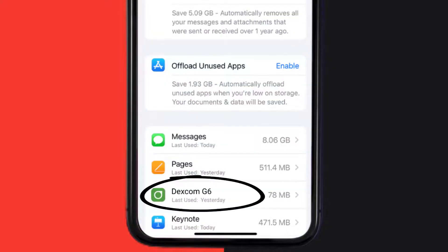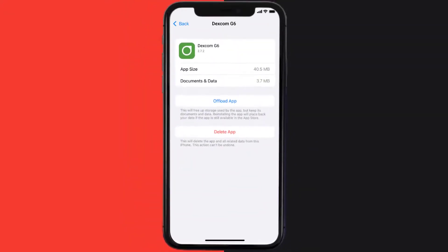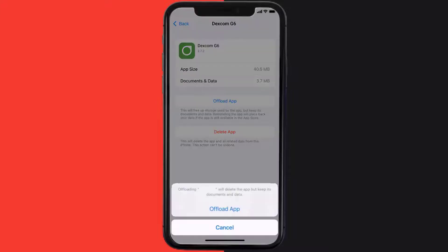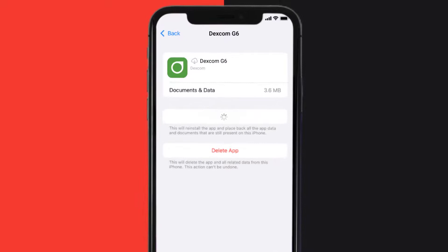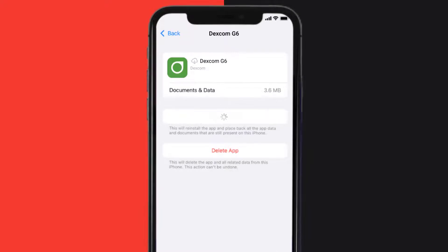From here, search for the Dexcom mobile app, and then tap on it. Once you're on this screen, you need to tap on Offload App. Tap again to confirm. It'll take a bit for processing, and then a reinstall button will show up. Simply tap on it to reinstall the app.